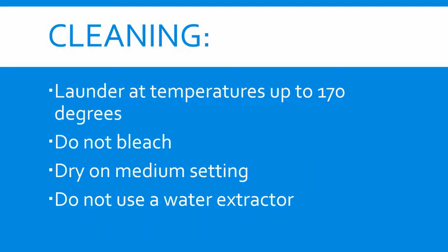The Comfy Spot belt can be washed. Make sure not to use water that is more than 170 degrees. Do not use bleach on the belt. Dry the belt on the medium setting and never use a water extractor on the belt.